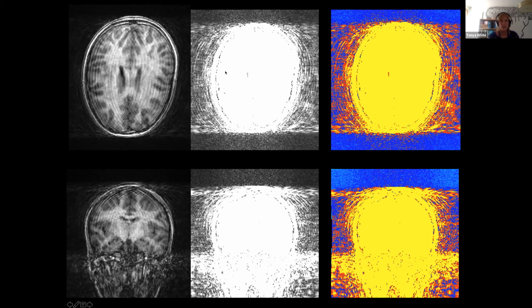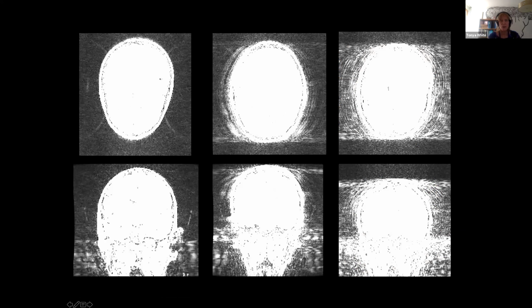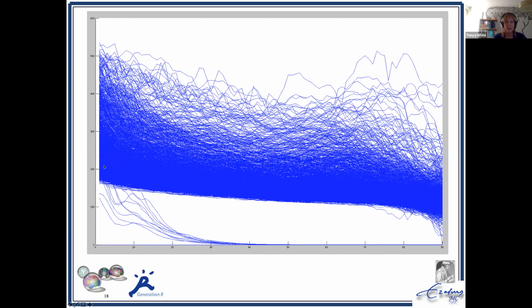And here they are all three together. So you can see this type of windowing, the same windowing for all three. And if you look at this interface, you measure, if you were to take a line and go out until you hit air, to give you an example of what happens in a brain, and you were to look at all those, here's the edge of the brain here. This is an overview of the lines that deviate from the brain. And this is actually, I think, the mean for all the images.